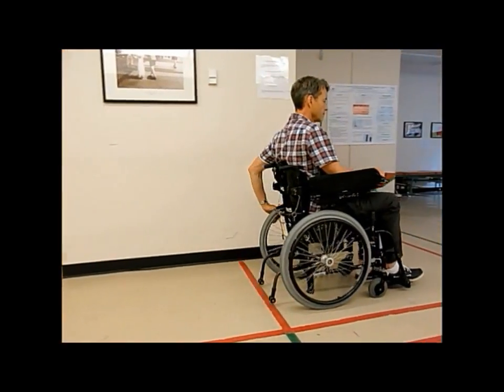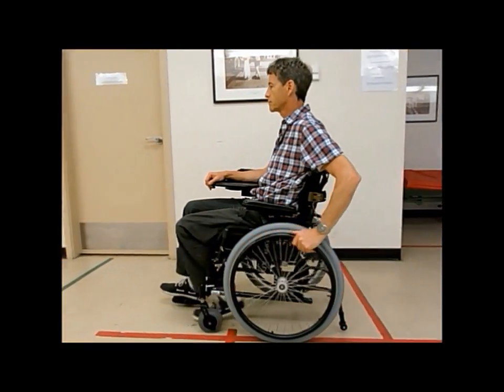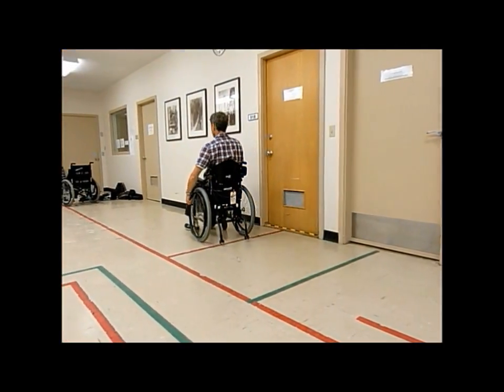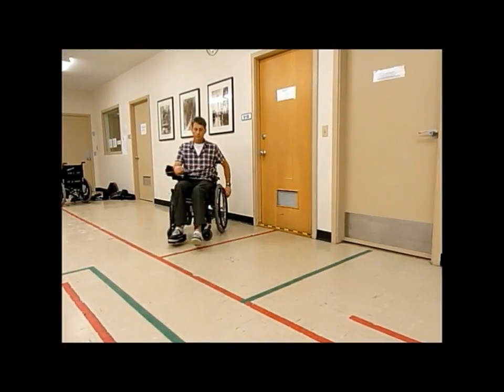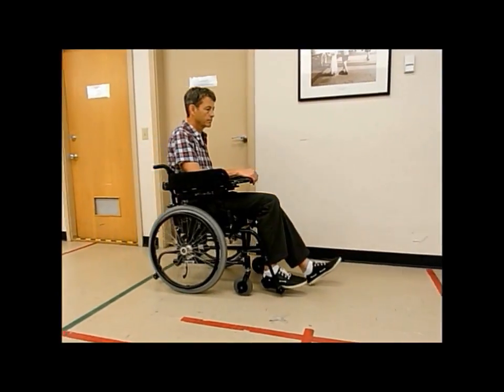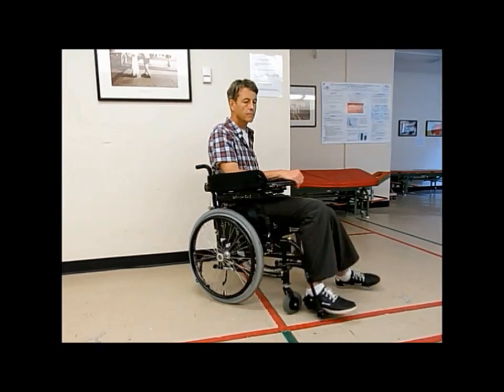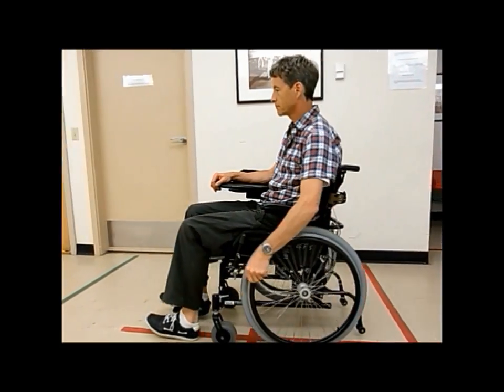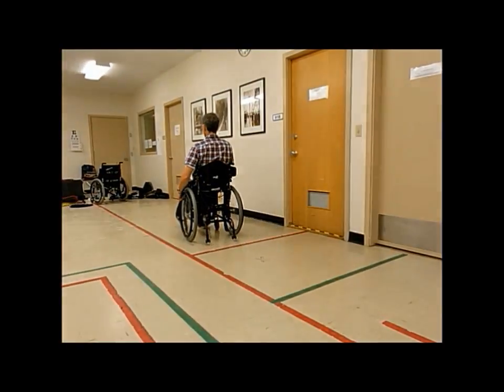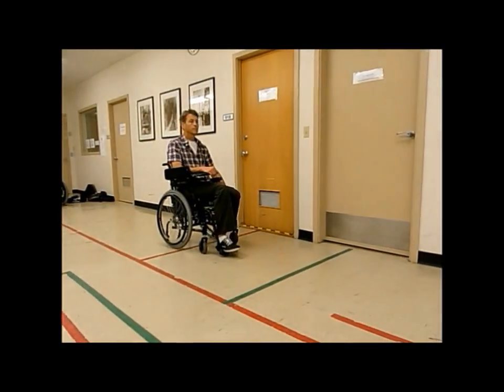Has the seat height impacted their ability to stand up or transfer because it is a lower seat height than regular? If yes to any of the above, is there anything that can be modified to meet the unique needs of your client? For example, changing the seat depth, the cushion, seat height, or wheel placement. If hemi-propelling is disruptive to the client's motor recovery, consider temporary or long-term power mobility. You may also recommend short distances for self-propelling, but portering or family assistance, or even power mobility for longer distances.